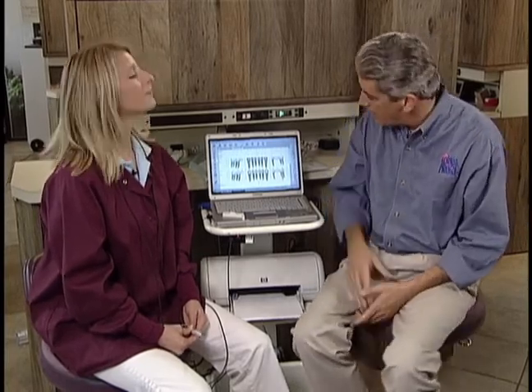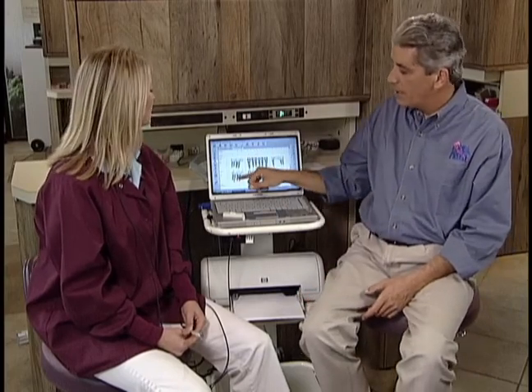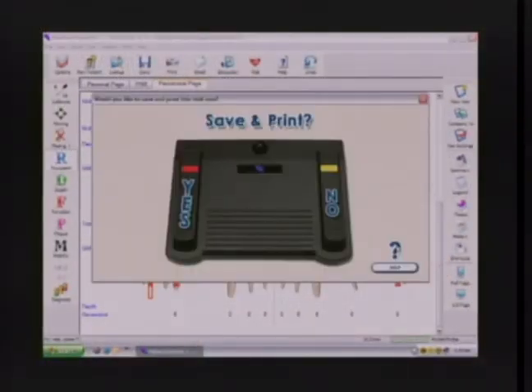Okay? We're at the lower arch on 18. Let's advance to 31. Midline. Does that help with the foot pedal? It does, yes. Okay. We're at the end of recession. Are you confident? Confident. Let's advance. Data collection complete. Now is the exam complete?